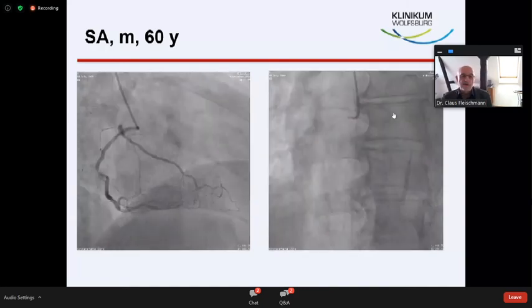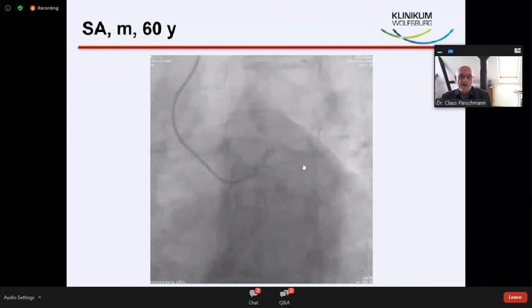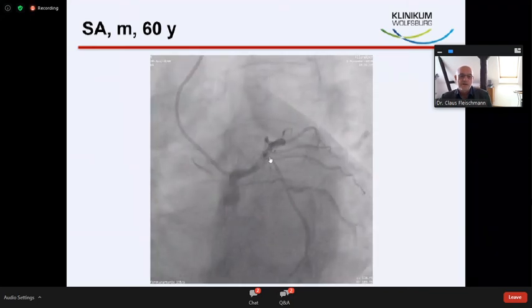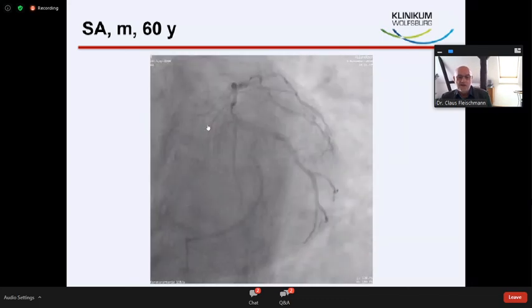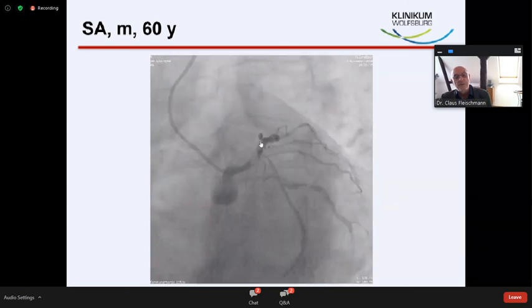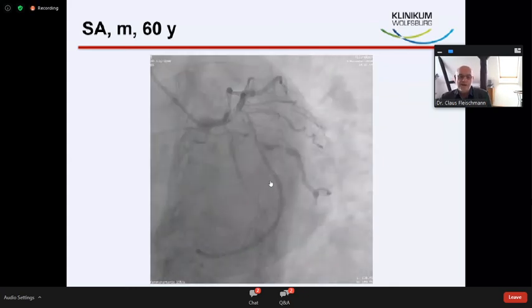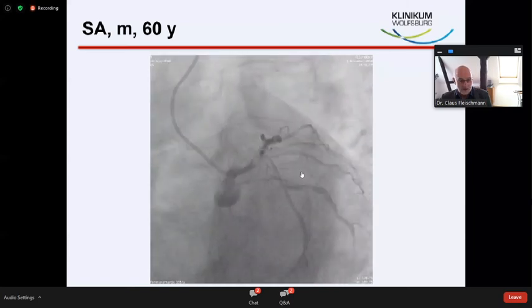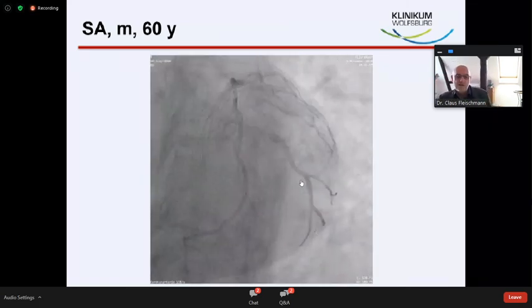So we do the injection of the left coronary artery, and we are prepared to find some serious thing, and we are surprised it's more serious even than we thought. We have a subtotal lesion in the left main, and during this injection, it took only maybe 20 seconds to have the catheter here and do the injection. The patient went rapidly worse. The blood pressure got down, and he was threatening to go into cardiogenic shock. And as you see, I can remove the diagnostic catheter immediately.